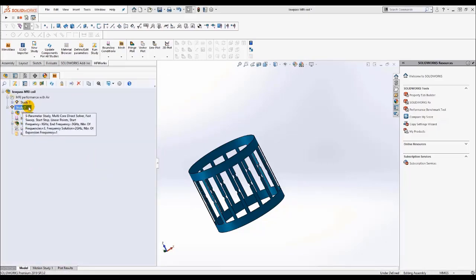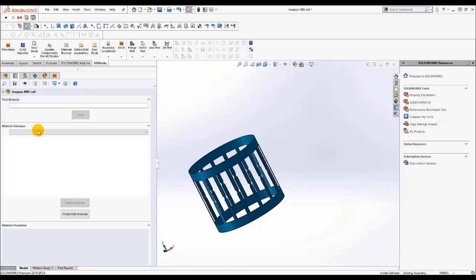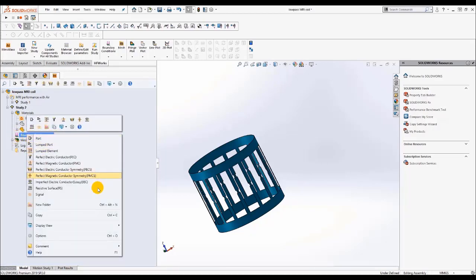As you can see here, for this new study we have 3 different sections. We have the materials. You have to start by assigning your materials, just by clicking on Apply. A well organized and rich library will be opened. You just choose your material, then validate it. Also boundary conditions: we have a list of boundary conditions according to your study type. We have wave port, lumped port that we will use for our case. We have PEC, PMC, etc.